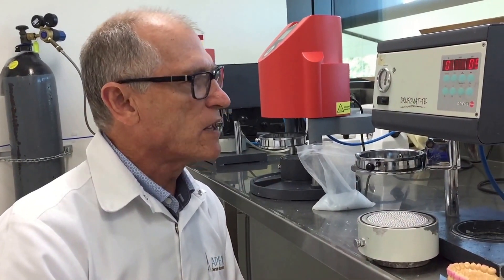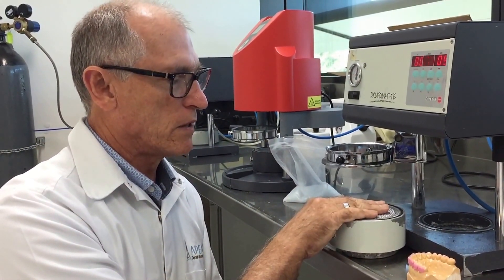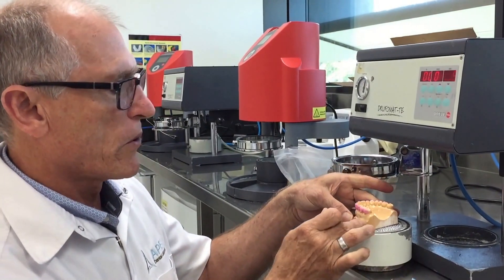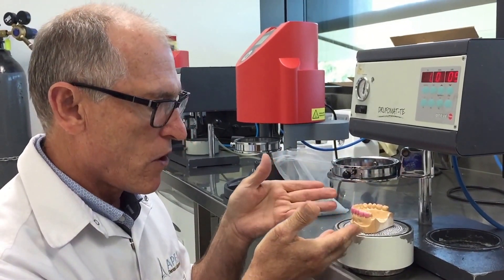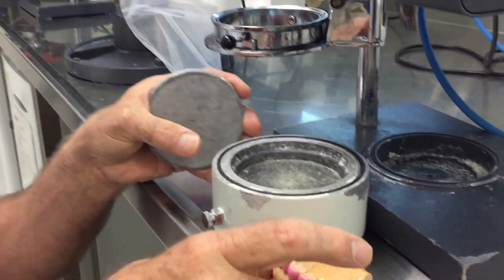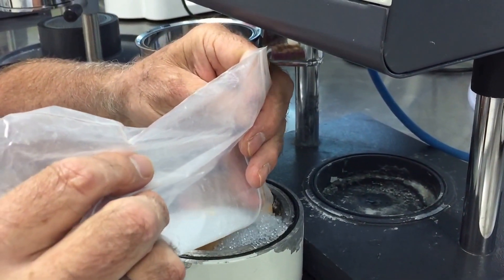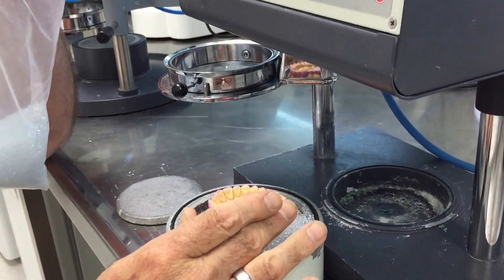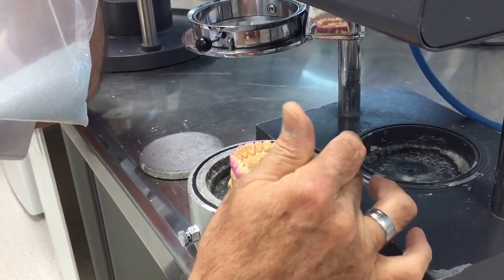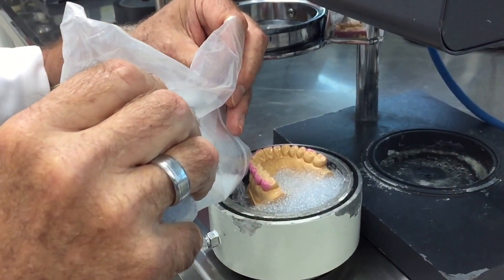Here we are with the pressure laminating machine. A little trick when pressure laminating is to make sure you use the table — if you've got a low model you can just sit your model on there and the blank won't pull too thin. If you have a tall model like I have now, but want to preserve its height as a study model, you can remove the table and place the model in here, then use some plastic beading usually provided by the companies with their machine.